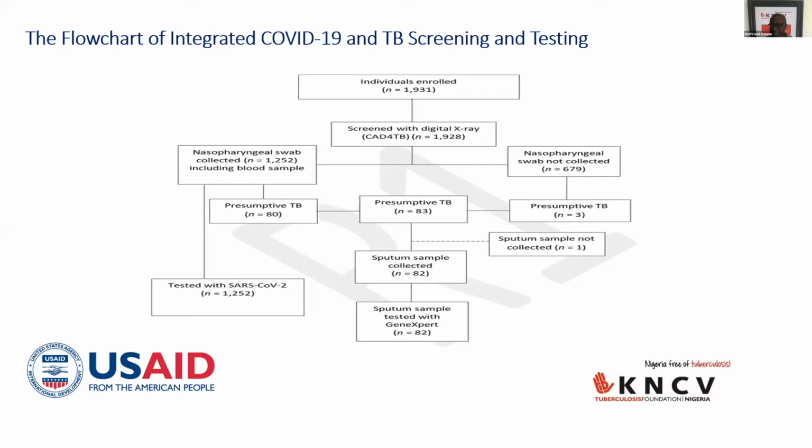And as I said earlier, those 2 vans have 8 modular GeneXpert machines. And right there on the spot, diagnoses were made. And since we were already working with the team of community healthcare workers providing services at resource centers, immediate linkage to care was equally done. And working with the state team, those that tested positive were equally linked to the COVID task force within the state for admission, those that merit admission in the selected admission centers during that pandemic.